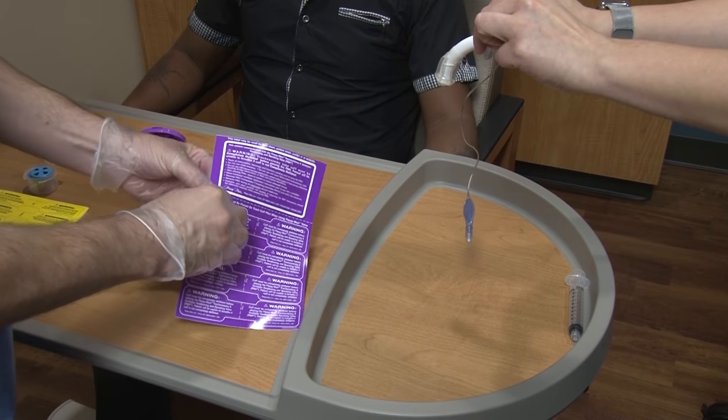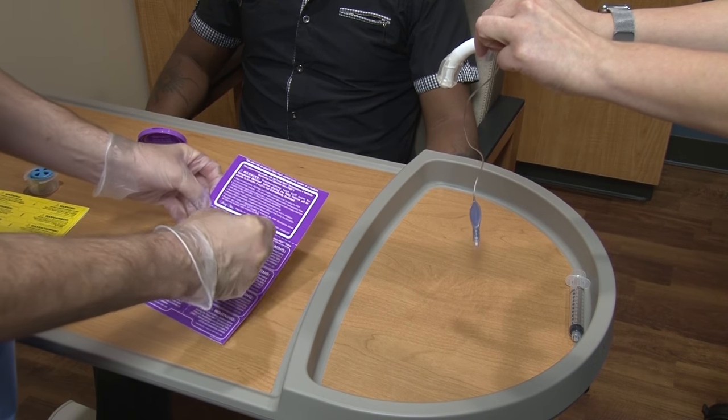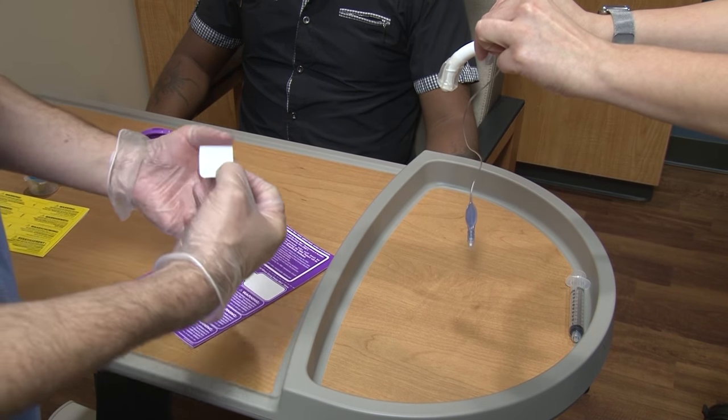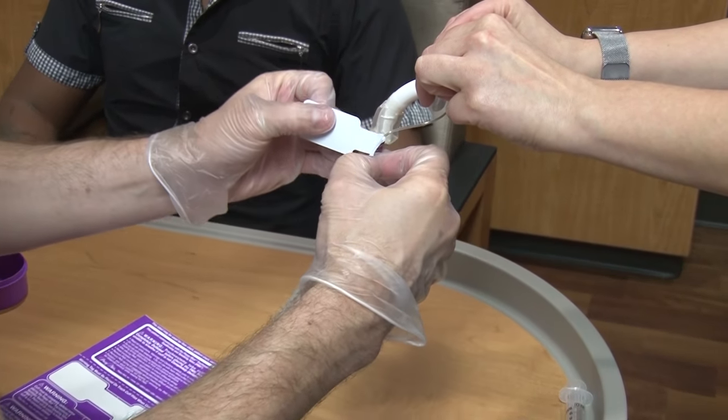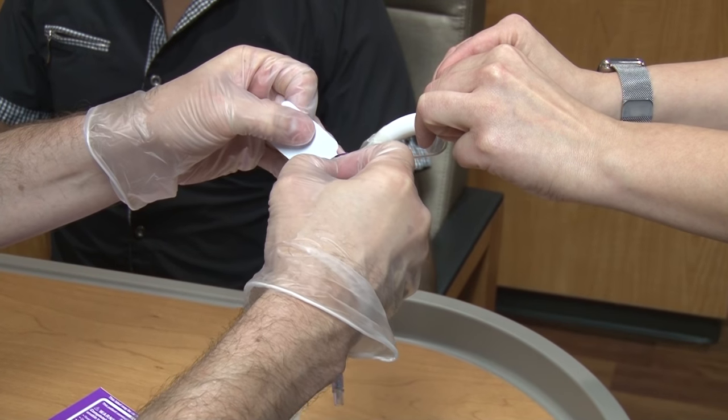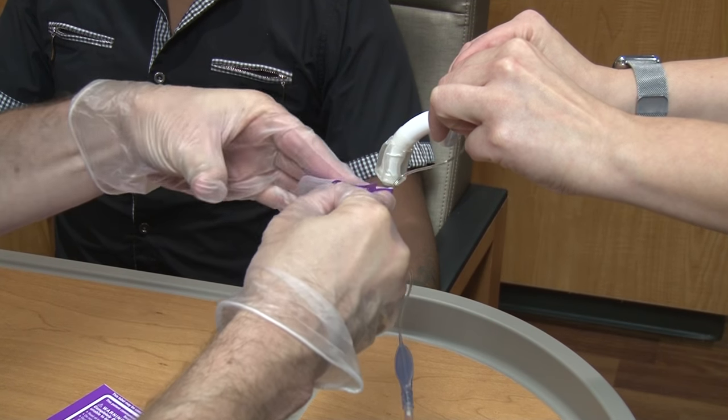The speech therapist will put a warning label on the pilot line to let all staff and family know to check and make sure the pilot balloon is flat before using speaking valves.